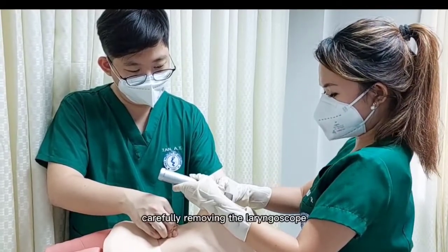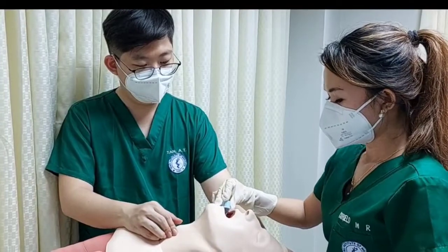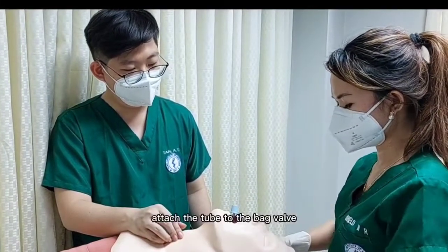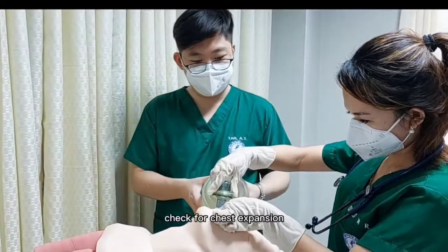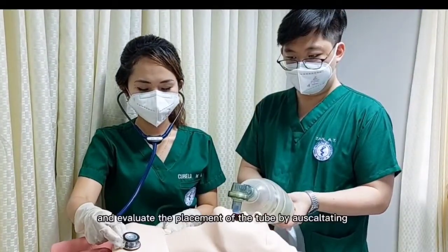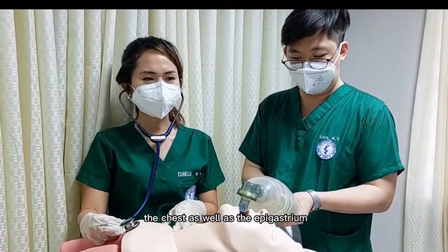Carefully remove the laryngoscope and inflate the cuff using the 10 ml syringe. Remove the stylet carefully while holding the endotracheal tube. Attach the tube to the bag valve mask resuscitator for oxygen. Check for chest expansion. Anchor the ET tube and evaluate the placement of the tube by auscultating the chest as well as the epigastrium.